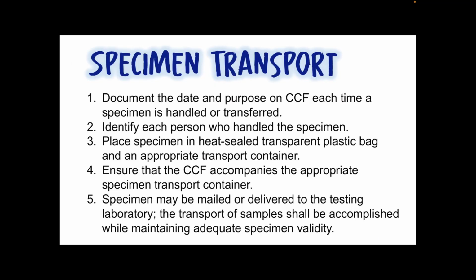How about for specimen transport? So for specimen transport, it is a must to document the date and the purpose on the CCF each time a specimen is handled or transferred. And again, during collection, minimize the number of personnel handling the specimen. And also for number 2, identify each person who handled the specimen.